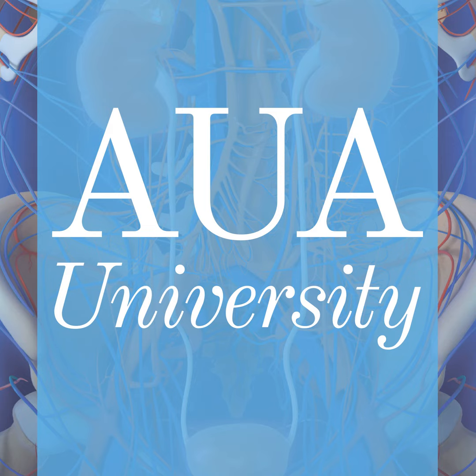The take-home of this was that this is one of the earliest studies that supplanted other PET imaging, whether it's choline imaging, which I had a large experience in, or fluciclovine, in the evaluation of biochemical recurrence. And I certainly think that a PSMA PET is now the gold standard for evaluation, and it's fairly ubiquitous right now in the U.S. I will mention, just as both my colleagues have mentioned, that it's not perfect. These lesions that were detected, even though there was a higher detection rate, were not biopsy-proven metastatic sites.